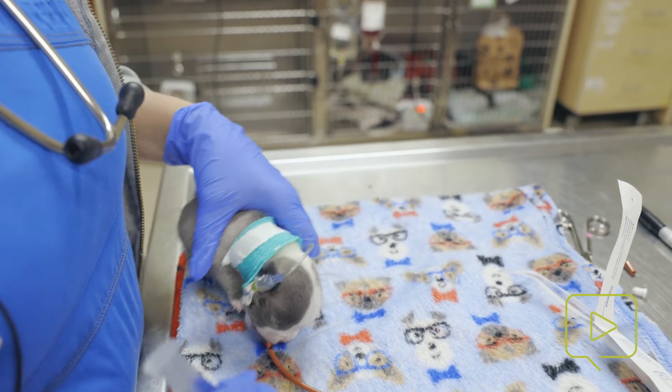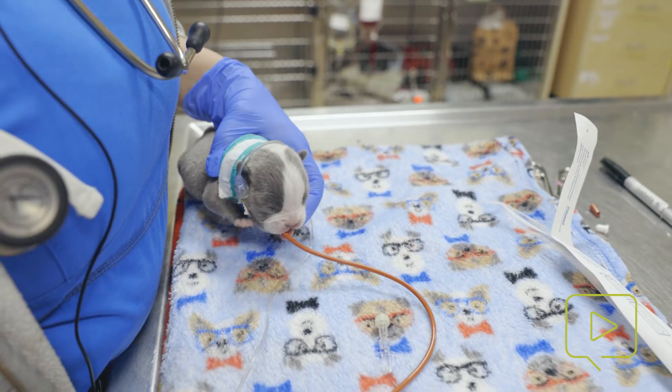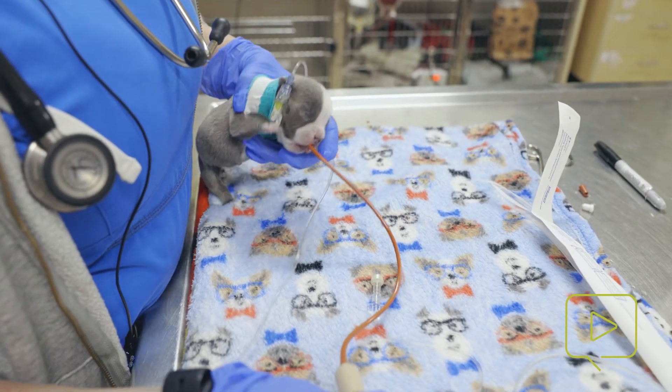You can hear air moving in him. We aspirate — no air. And then you just gently introduce that food.